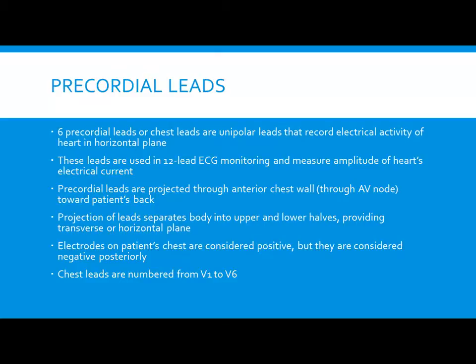Now, this is always something hard for me to picture in my head. But if you look at the heart right there, it's giving me a view of each section of the heart, all right? And it forms the epicenter there where we're getting the view from the heart to that electrode.